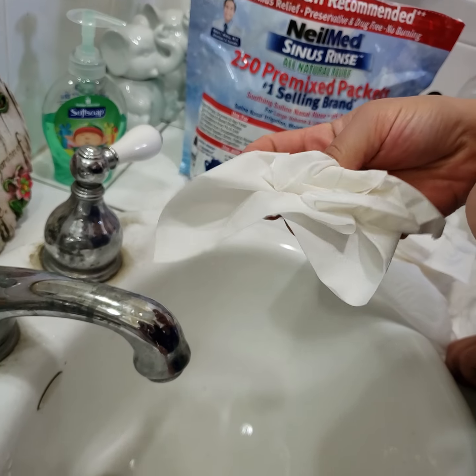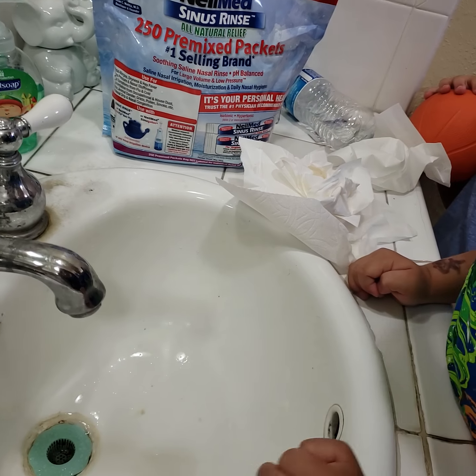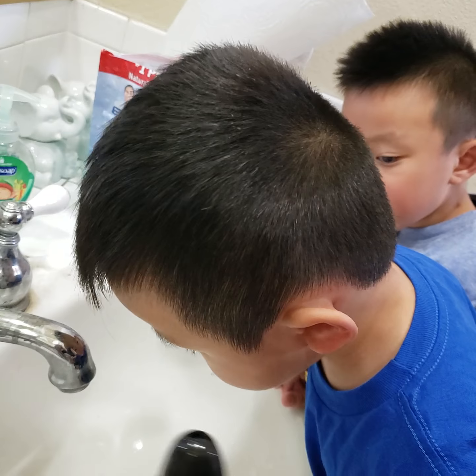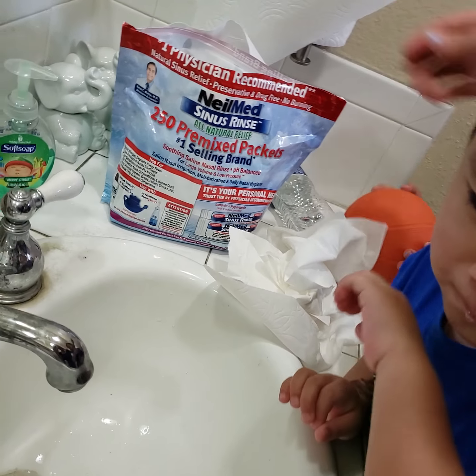Mom, that's a lot of boogers. Do you feel better? Let's do another one. One more time. Do you drink it? Okay, spit. Do it on the other side, one more time. You scared? Open it, you have to open your mouth.